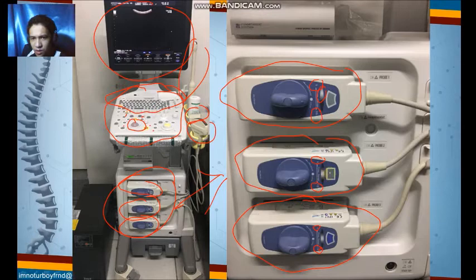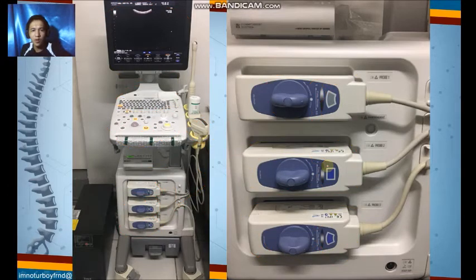And then for number 2, the second transducer, and then the third transducer, the white portion is directed towards the center. So that's approximately in between 5 to 10 megahertz. So that means it leans towards high frequency diagnostic ultrasound. So this is low frequency, and then these are high frequency probes. When we talk about the low frequency probe, this is the curvilinear, and then the high frequency, we have the linear and then the endocavitary probes.